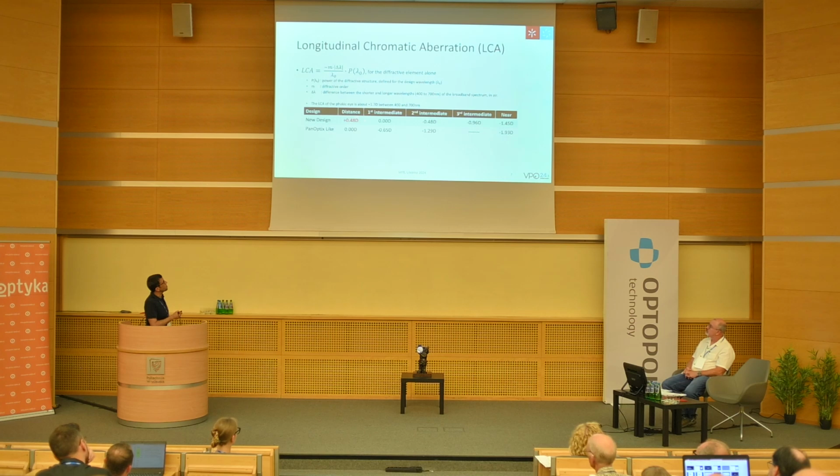The drawback with this approach is that we use a negative order for distance vision in order not to introduce transition zones. So the lens has some positive chromatic aberration that will add to the positive chromatic aberration of the cornea, in the distance focus. But by doing it this way, as you can see here, this is a pentafocal lens. So you have 5 major foci. By doing it this way, you can attenuate this effect.